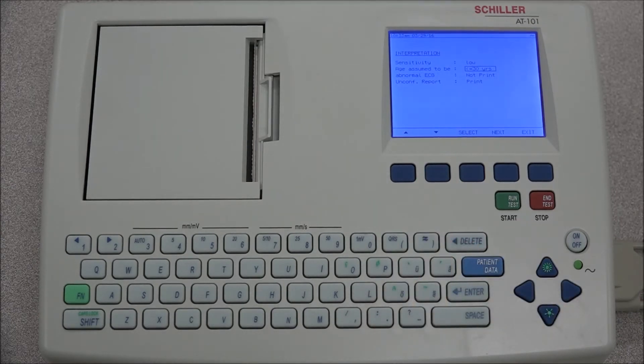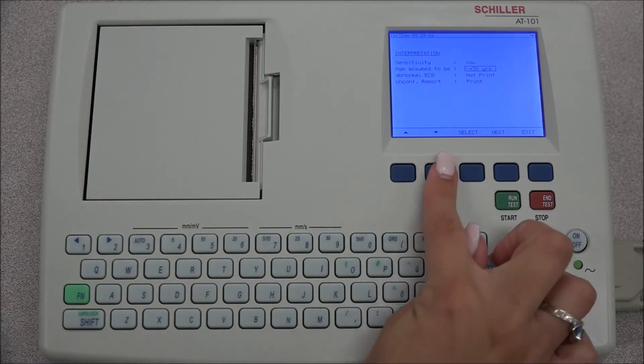The interpretation sensitivity can be set to high or low, which will suppress certain non-specific ECG diagnosis. Under age assumed to be, the patient's age range can be selected. This setting is only applicable when the patient data has not been entered. When a patient's date of birth has been entered, this setting is ignored.